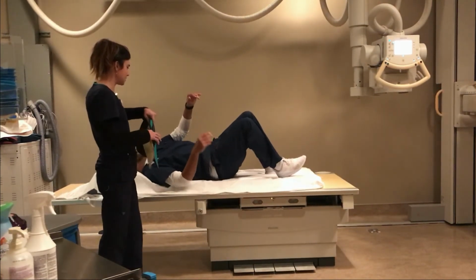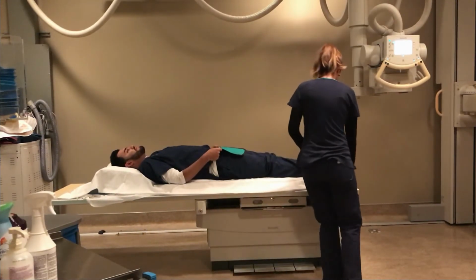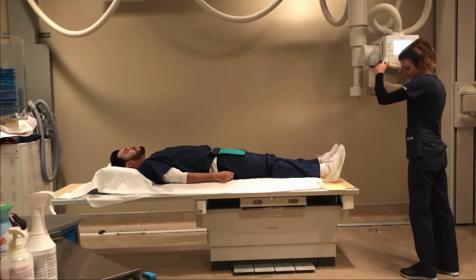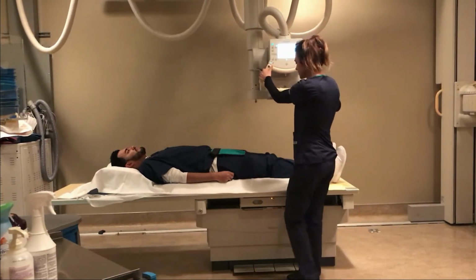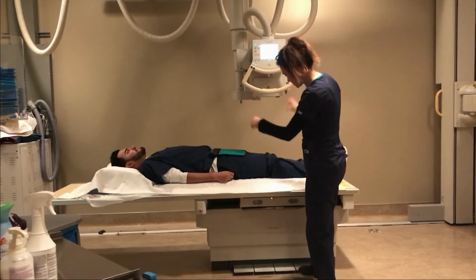I'll go ahead and put the shield on you. So I've got it detented transversely, and now I'm just detenting it longitudinally.